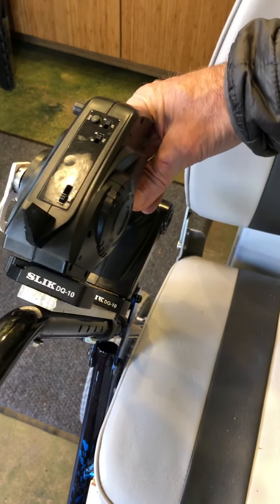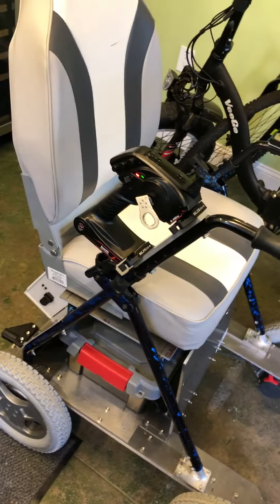And then mount it in the seated position, so when you're seated you can use it.